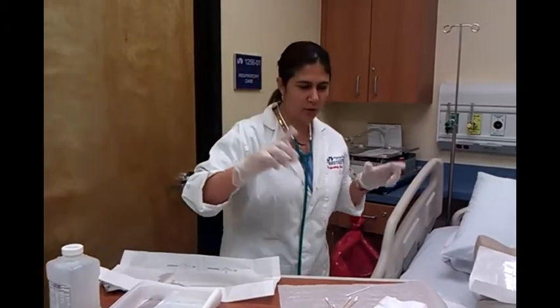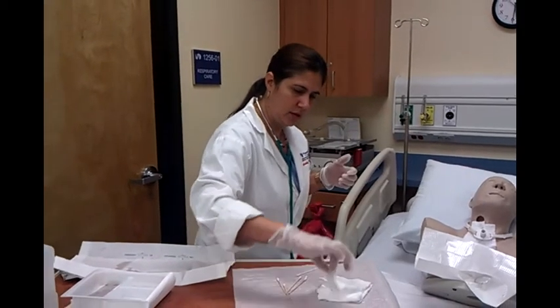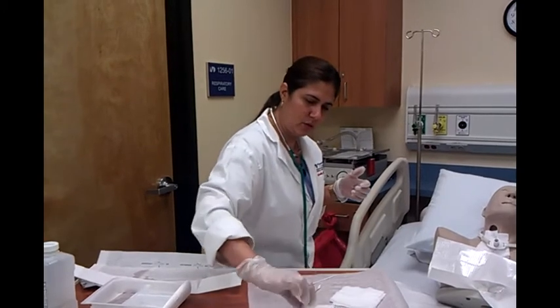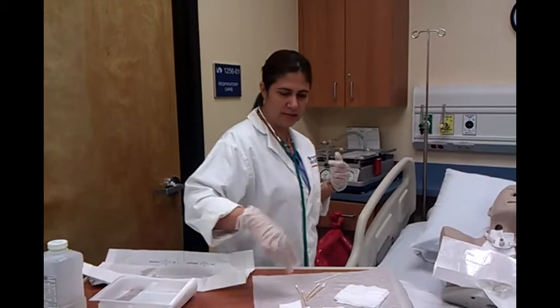After I put on my sterile gloves, I'm going to separate the gauze I'm going to use, the one I already cut, to put around the flange on the skin.